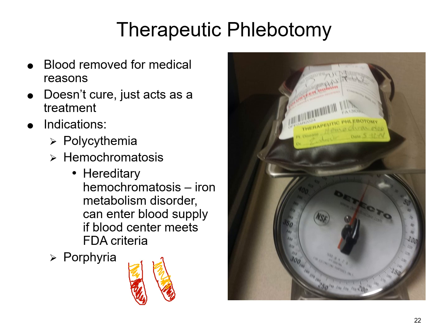When you're working in blood bank and your eye starts training to inspect those tubes, you're going to notice a difference when you see patients come in that have lower hemoglobins.